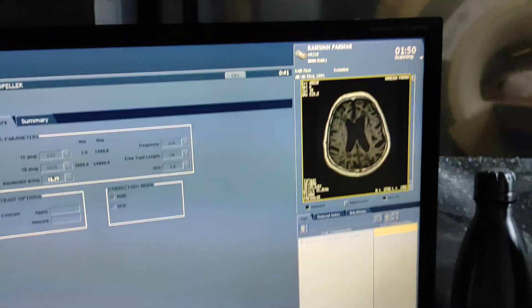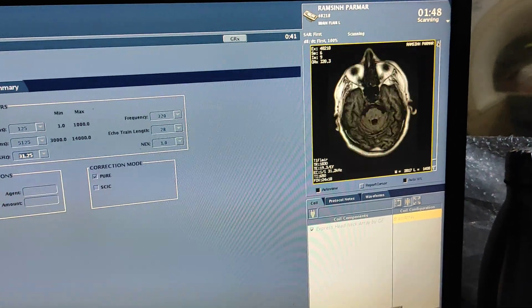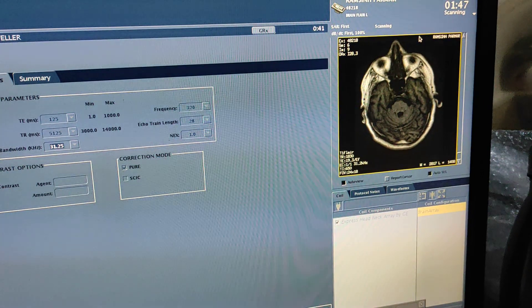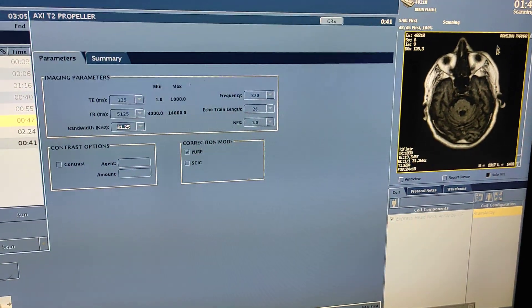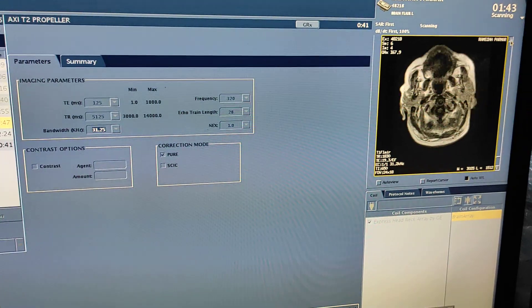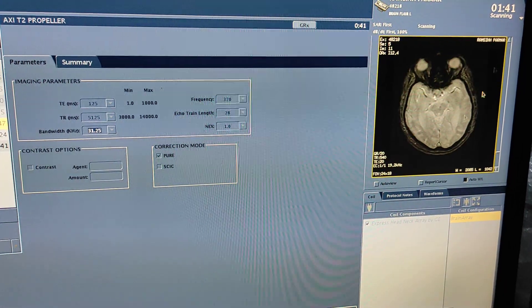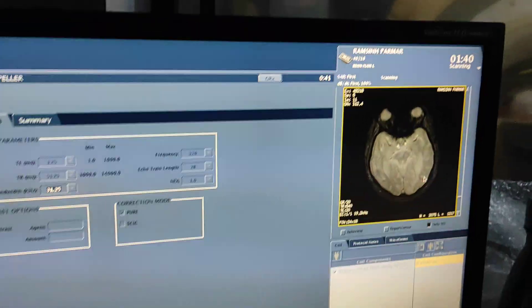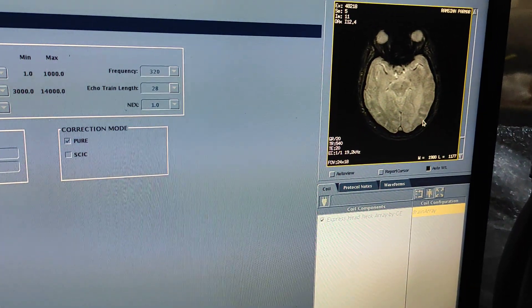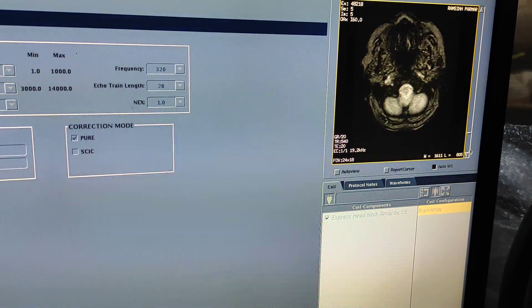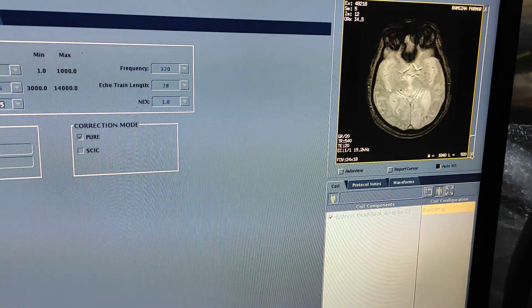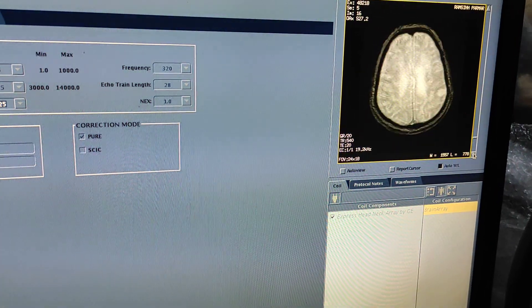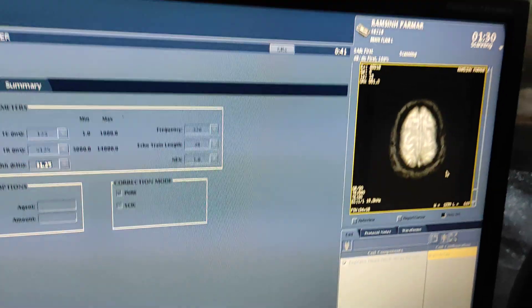You can see the axial T1 sequence is also giving motion. This is okay, there is no issue. In the T1 and GRE sequence, I can diagnose. That quality is sufficient.